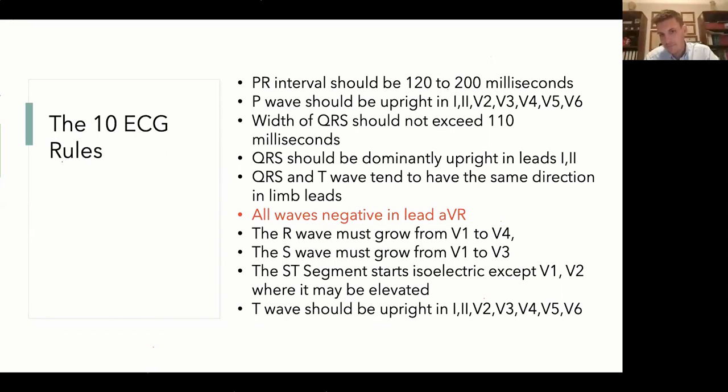Correct. And it's all a matter of perspective of the patches on the heart, and how the signal, how the depolarization, is conducted.